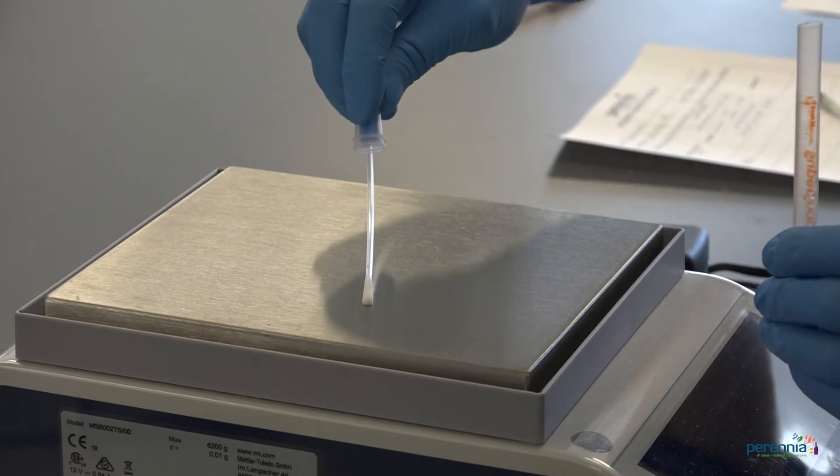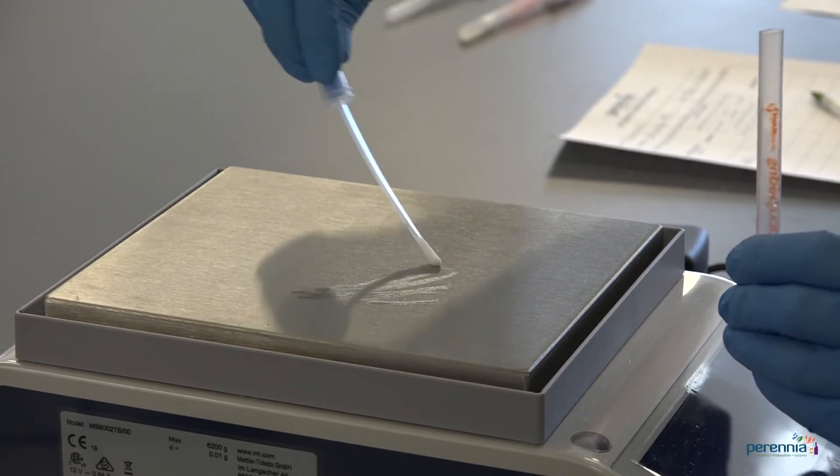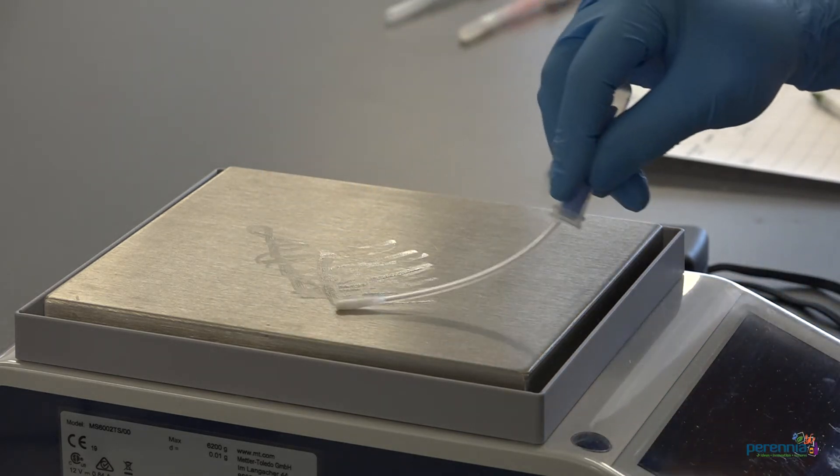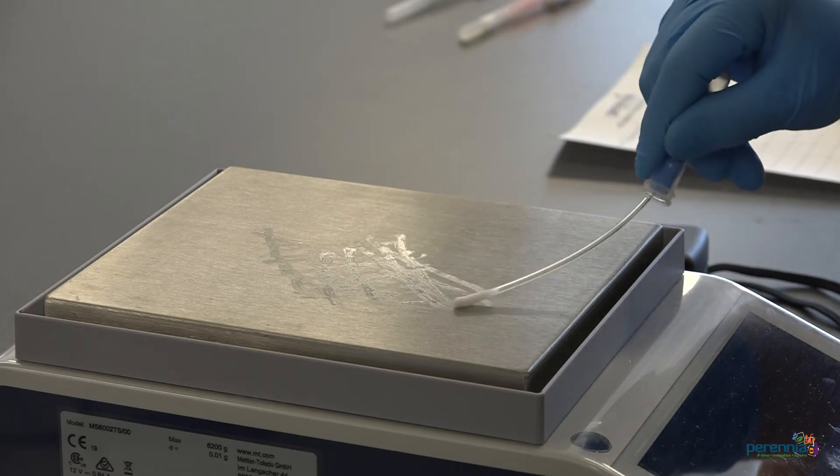Step number four, swab a four by four inch area using a crisscross pattern ensuring even coverage. Using even pressure, rotate the shaft of the swab. Be careful to not touch the shaft of the swab.